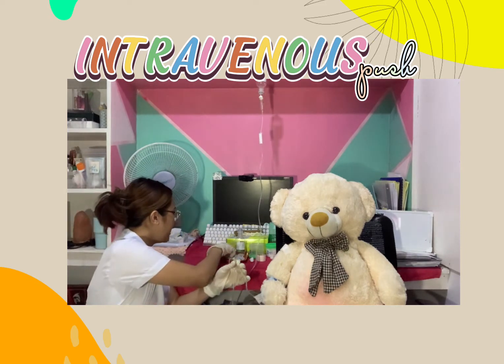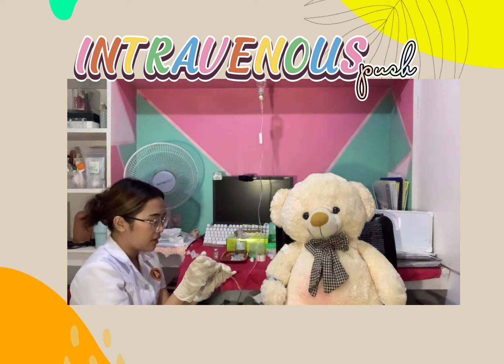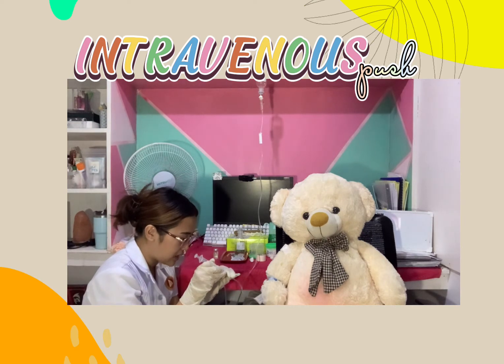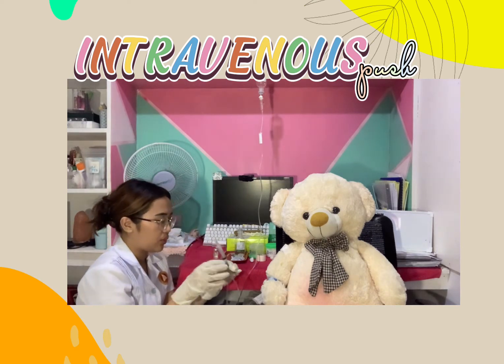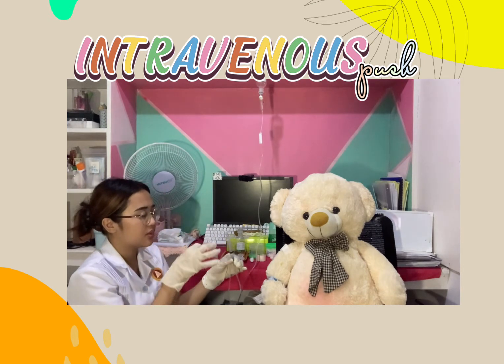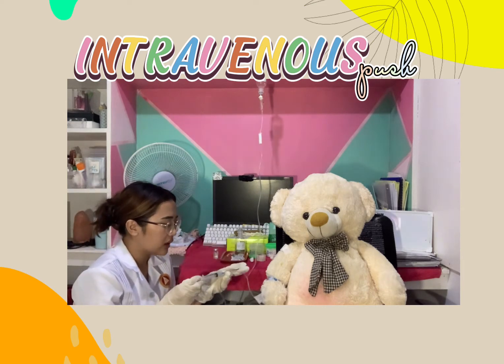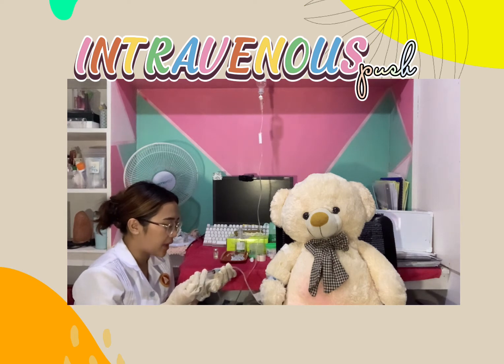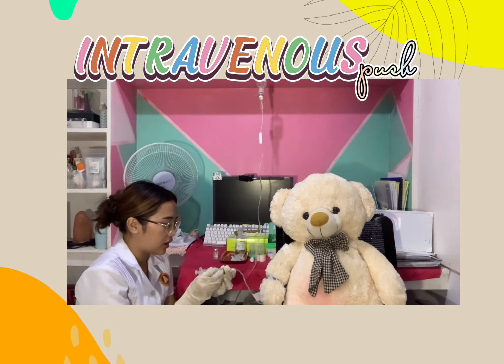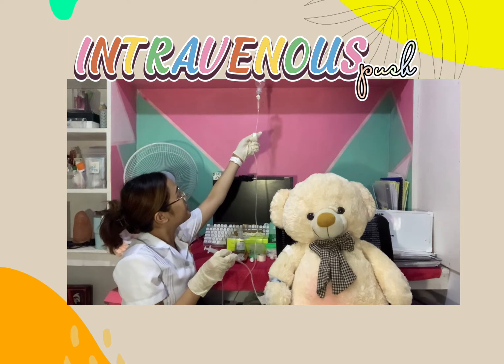So, by the use of our syringe, if we are using the needle system, we will insert it at the center of the injection port. And then when we are using needleless materials, we will remove the syringe and insert it on the port. And then after that, we will just slowly administer the medication at the recommended infusion rate. And then when the medication is already administered, we will open the clamps.